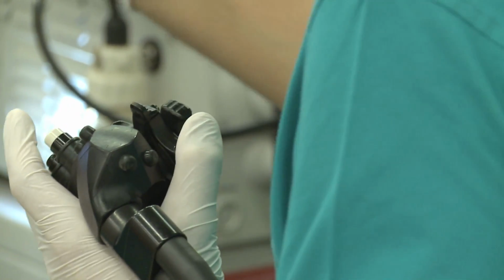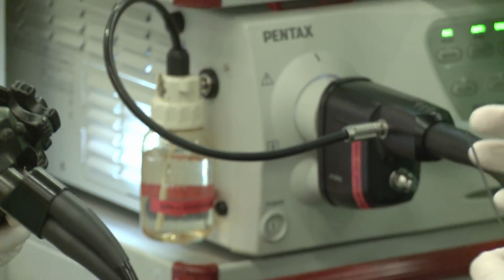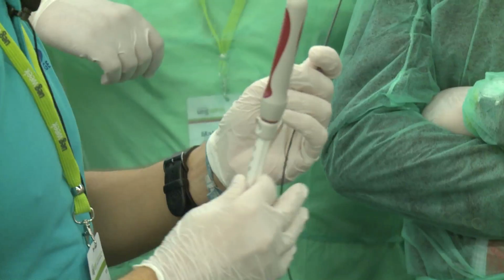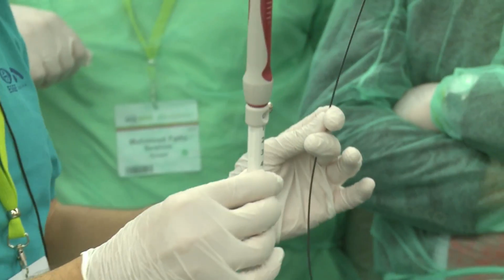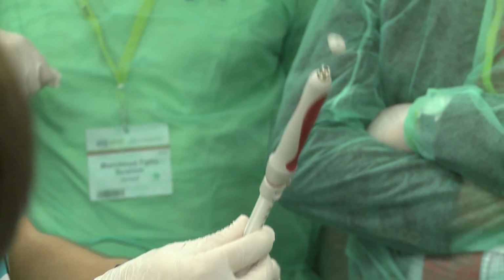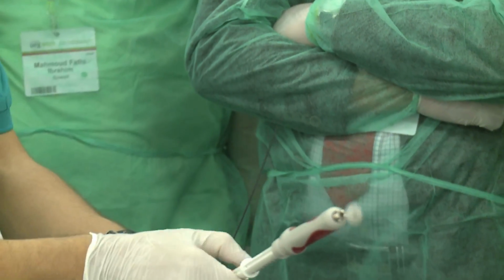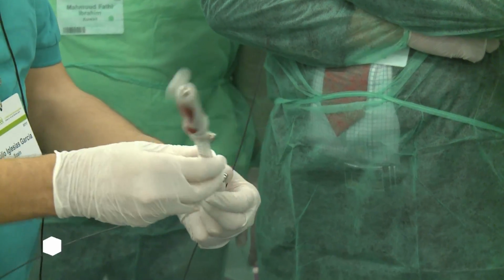For the Procore, it's very important to have... this is the 25 Procore. Can you all see me? Before starting to do an FNA, we need to fix the needle. First, we need to put the needle at the 0 centimeters position.